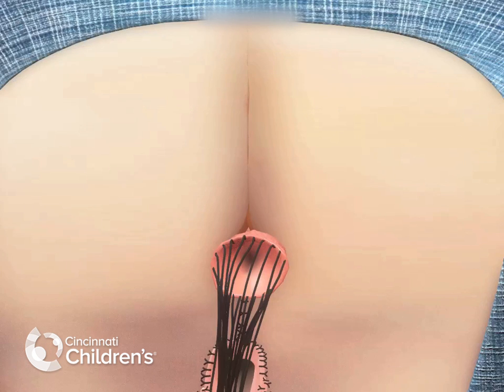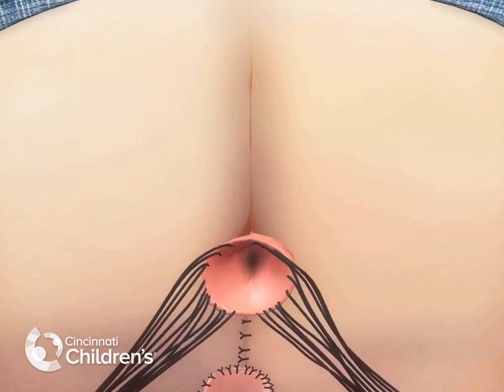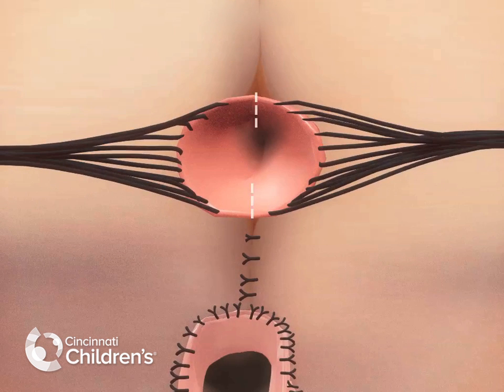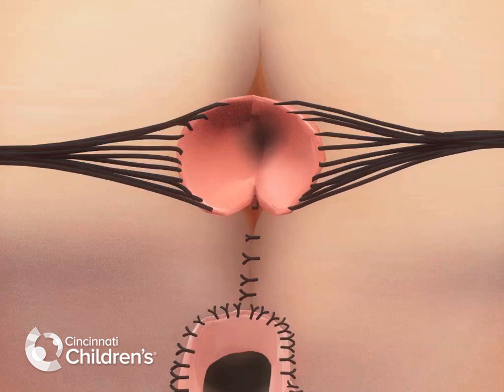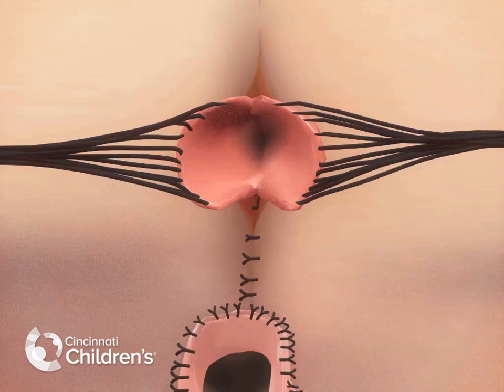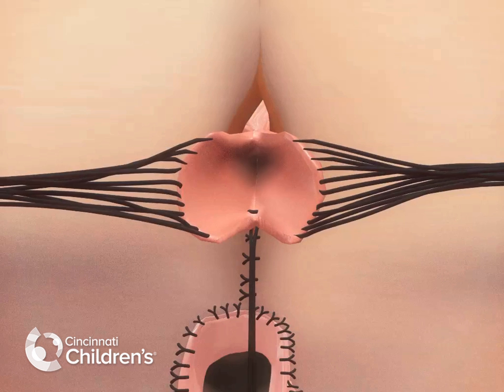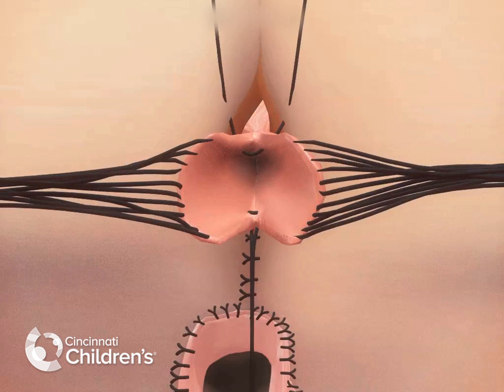The anoplasty is now performed. The rectum is first divided in the midline down to the level of the skin. The sutures are replaced in a U-type fashion from the skin through the bowel and back out of the skin at the 12 and 6 o'clock positions to anchor the rectum.